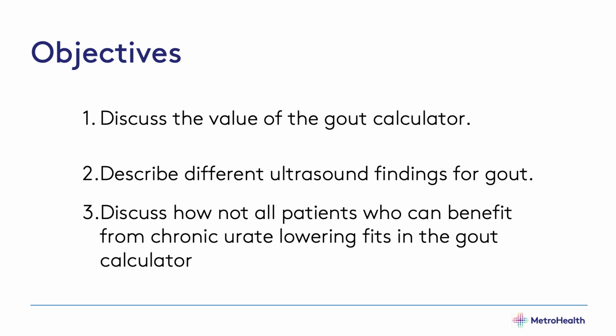Today, I'm going to talk to you about gout. I'm going to discuss the value of the gout calculator in case you don't know about it. I'm going to describe the various ultrasound findings for gout. And I'm going to discuss how not all the patients who can benefit from chronic urate lowering fit in the gout calculator.